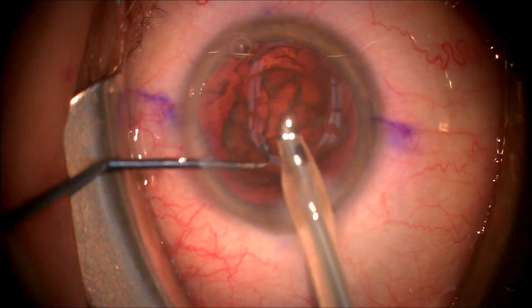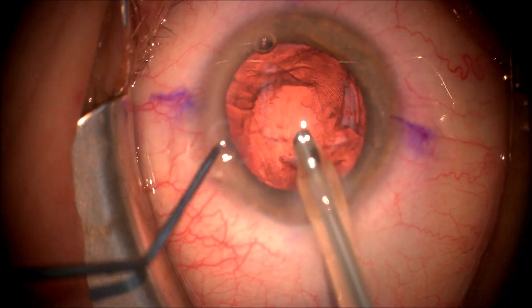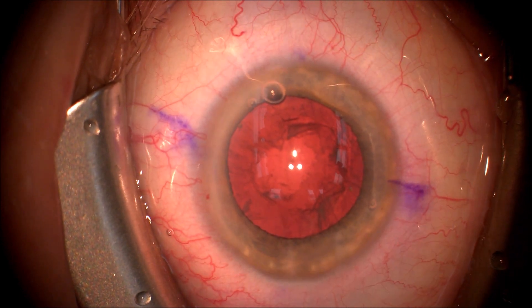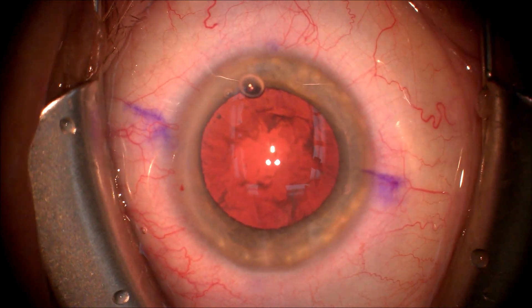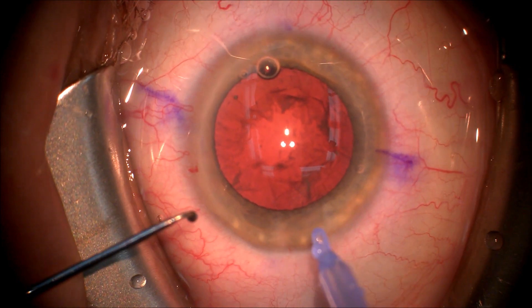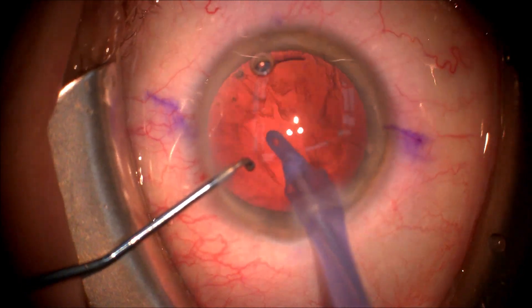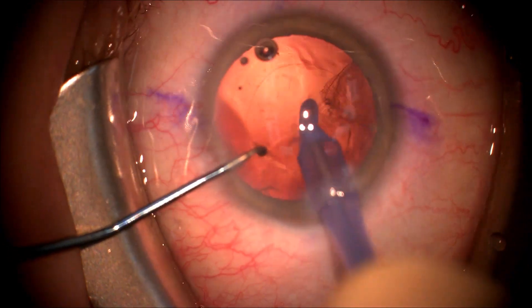You can see the cataract is nearly completely removed. The epinucleus removes as well. We've now removed the phacoemulsification handpiece from the eye and are left with the cortical material, which is the surrounding softer part of the cataract.